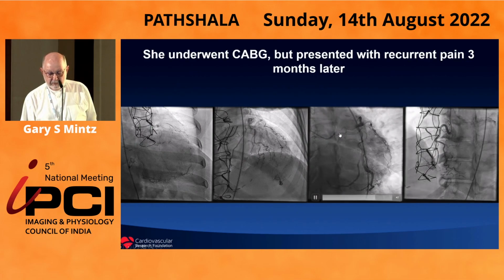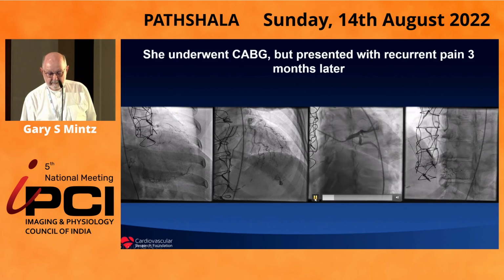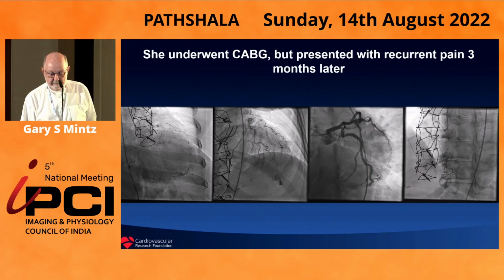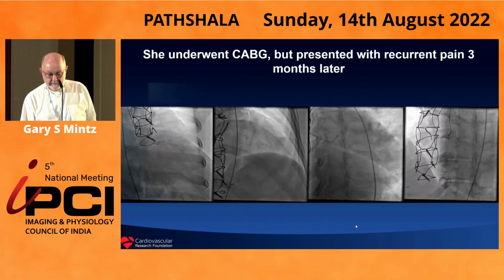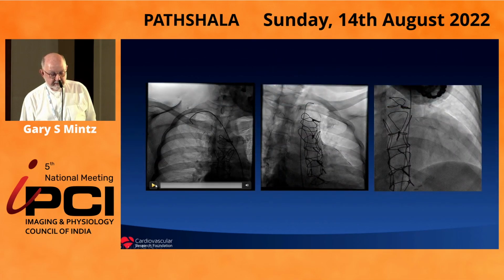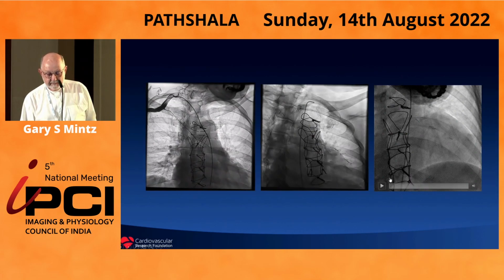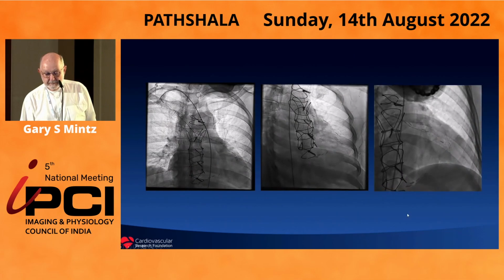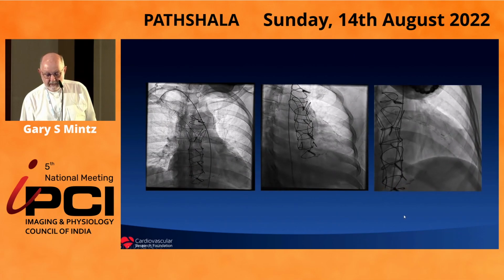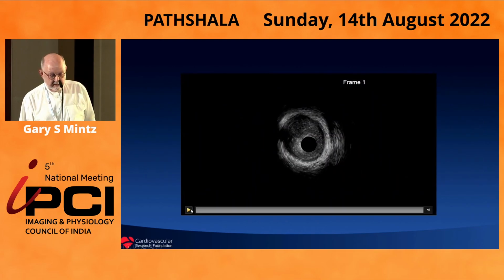I mean, this one right here is pretty dramatic. No surprise, her grafts are either atretic or closed. And then she was sent to us.